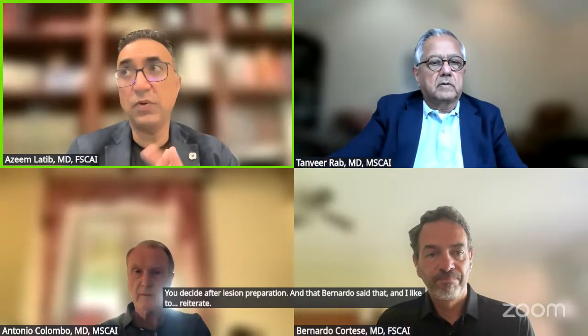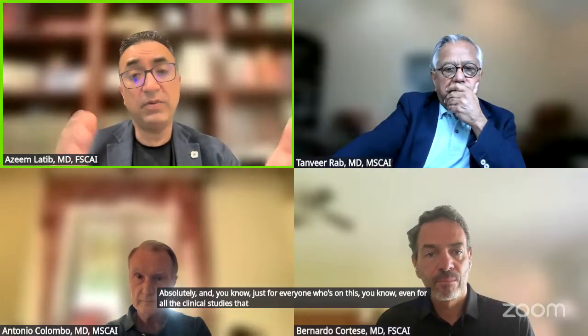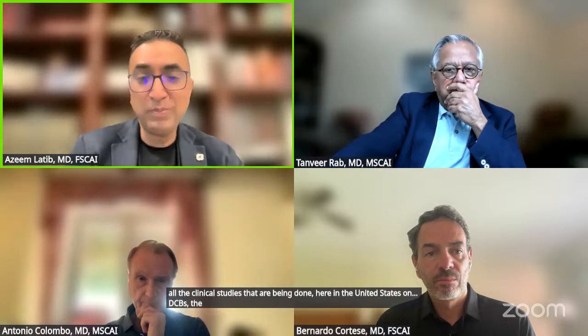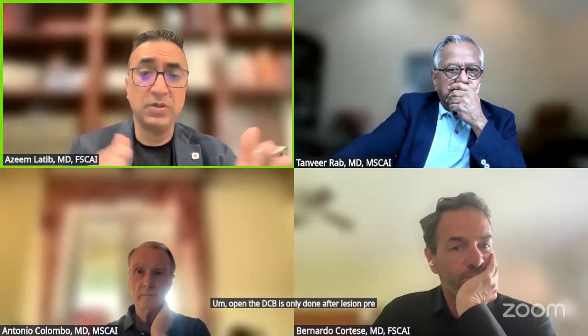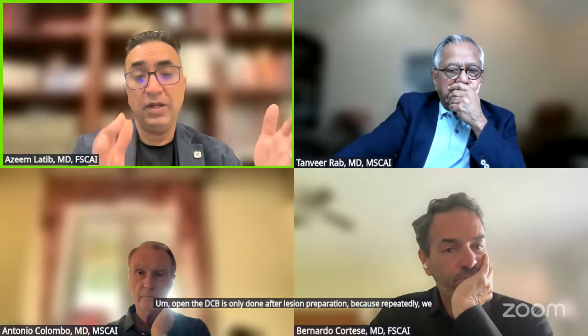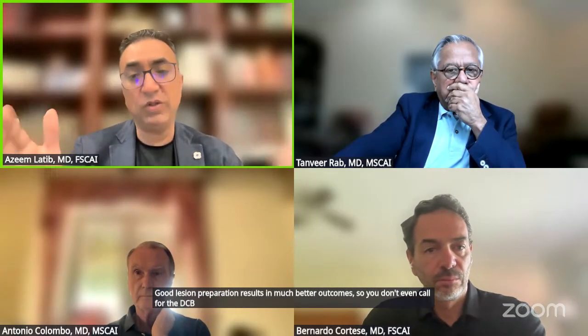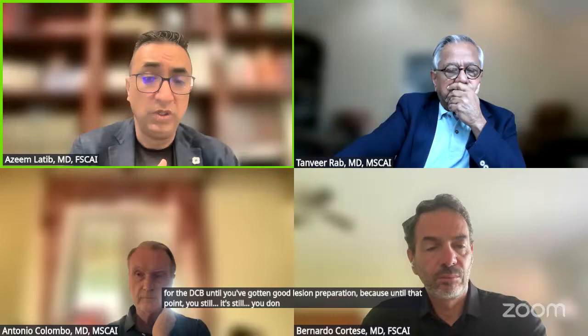Absolutely. And just for everyone who's on this, even for all the clinical studies that are being done here in the United States on DCBs, the decision to enroll the patient, either randomize them or open the DCB, is only done after lesion preparation, because repeatedly we've shown that good lesion preparation results in much better outcomes. So you don't even call for the DCB until you've gotten good lesion preparation, because until that point you don't know what you're going to do. Your decision is only made after great lesion preparation.